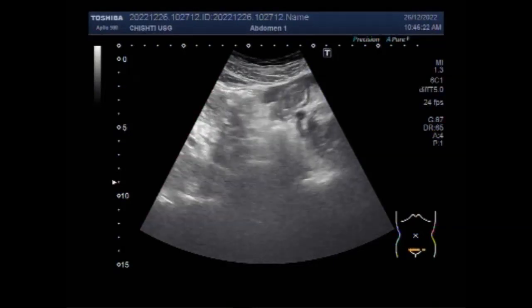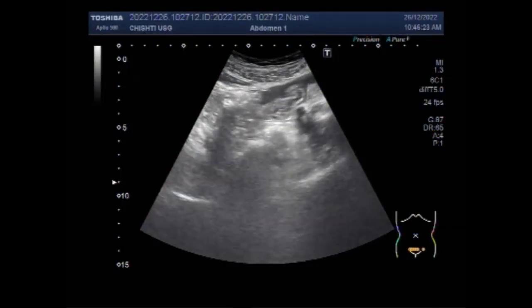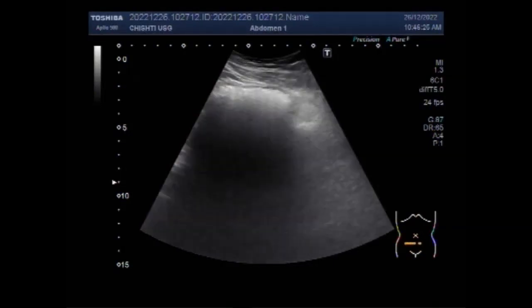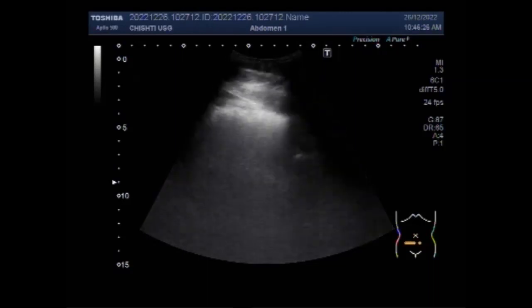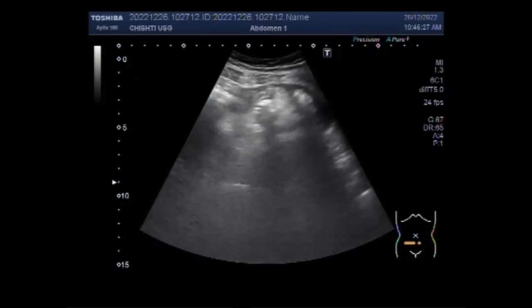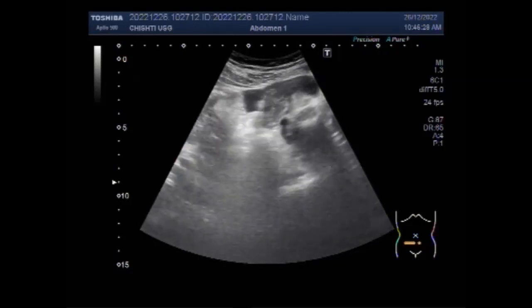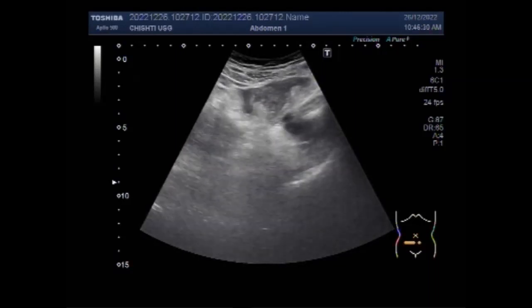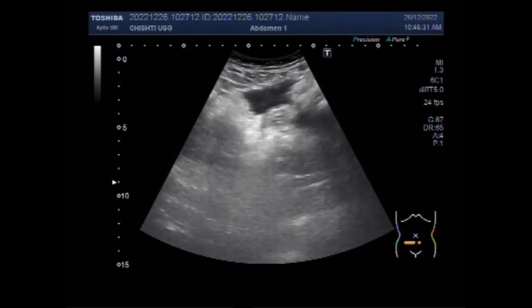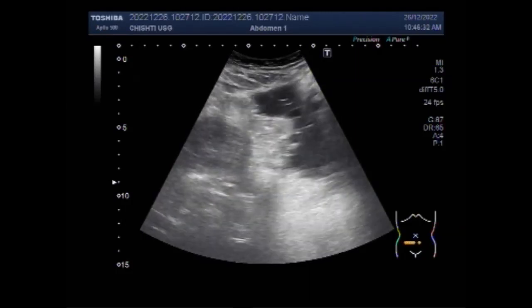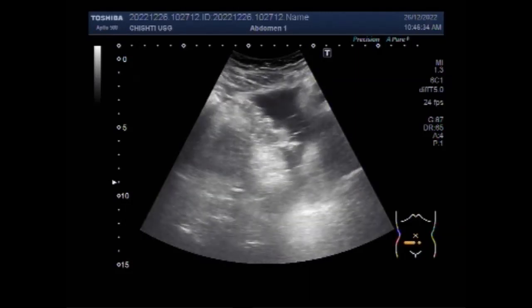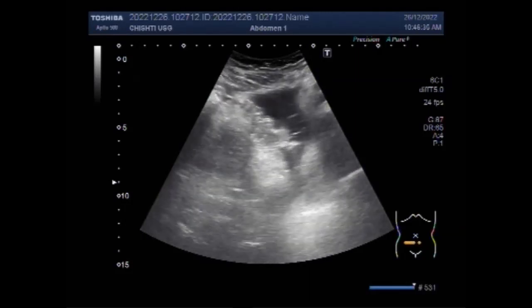Dear viewers, I hope you are all fine. This ultrasound video shows a case of dilated gut loops with intestinal obstruction and perforation in a child of about 6 years.